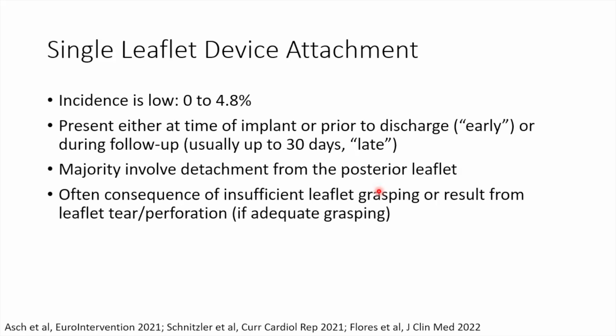So coming back to SLDA, the incidence, as I mentioned, is generally low. It tends to happen immediately, most of the time, either at the time of implant or prior to discharge, so on your immediate post-procedure TTE or 1 day post-TTE. But they can happen later during follow-up, usually up to the 30 days, but it has been seen at 6 months to 1 year as well, but they're considered more late.